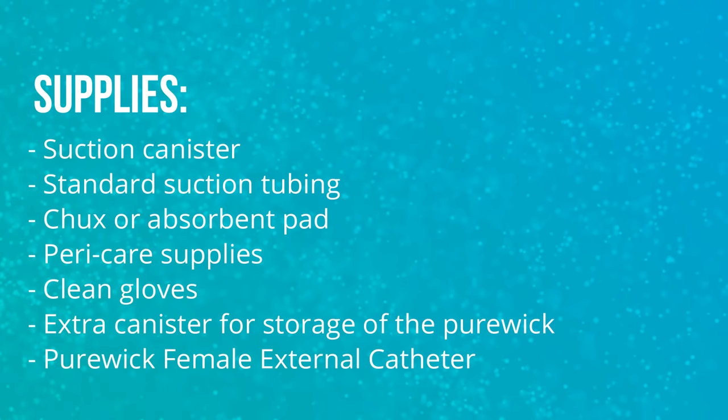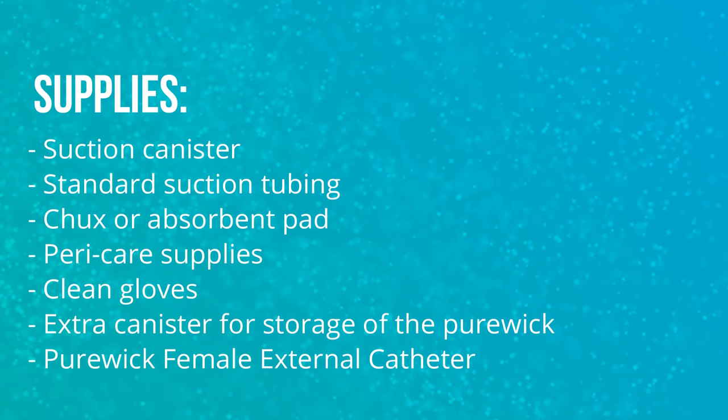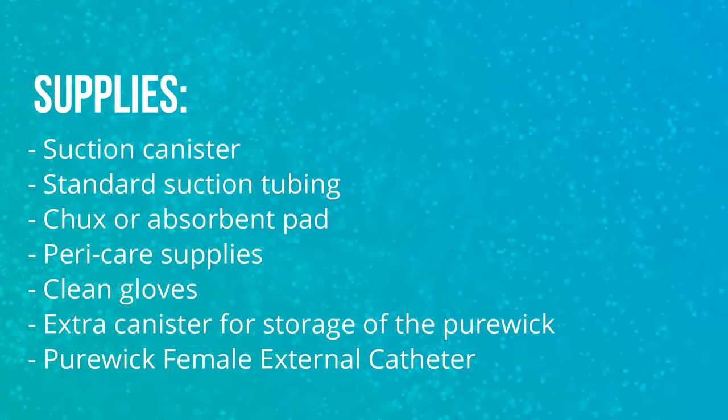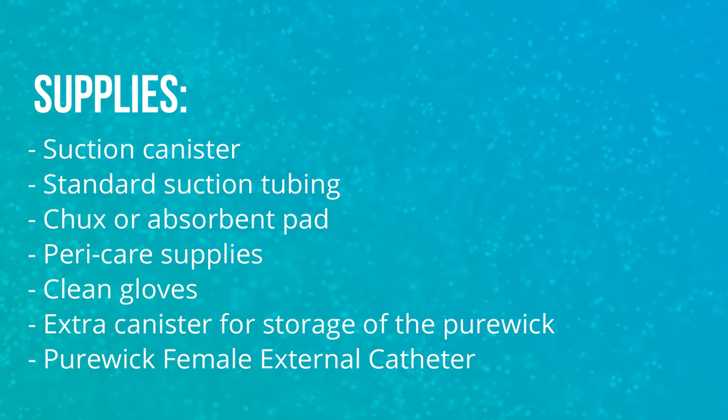What you will need for application of the Purewick: a suction canister, standard suction tubing, chucks or absorbent pad, peri care supplies, clean gloves, an extra canister for storage of the Purewick, and the Purewick female external catheter.